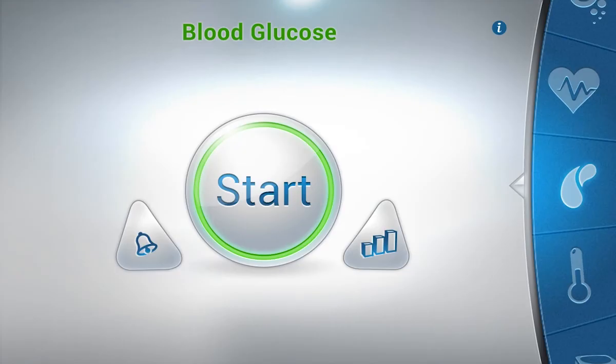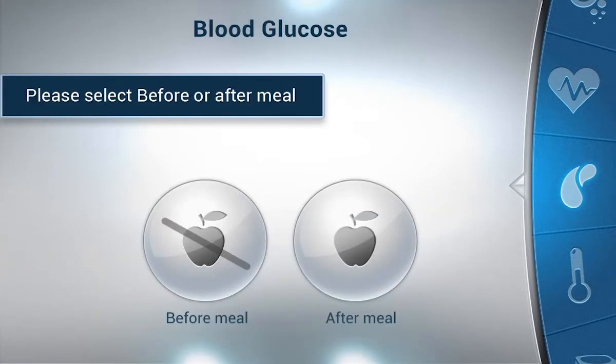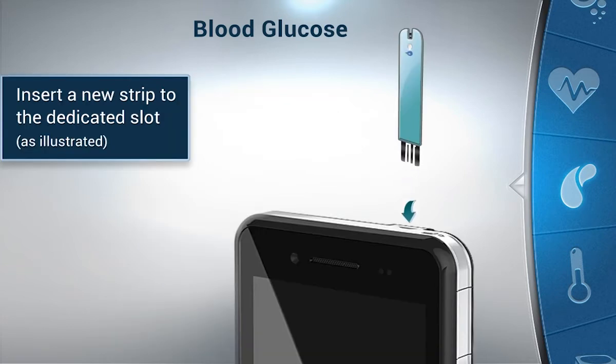Click on the start button on the main test screen. Please specify whether you are before or after a meal. The device will instruct you to insert a new test strip into the device socket. Push the new test strip into your device until it stops.